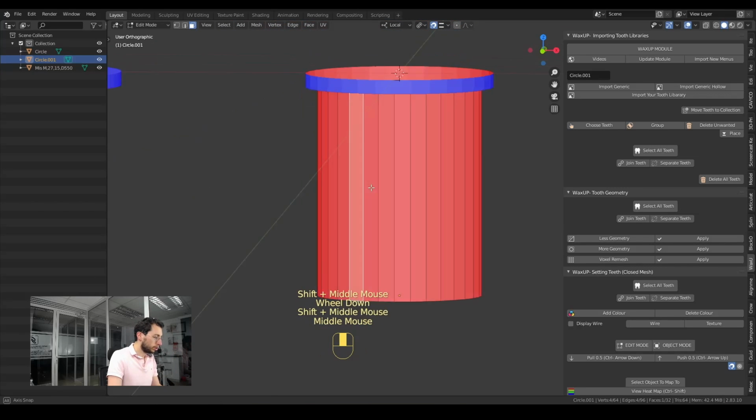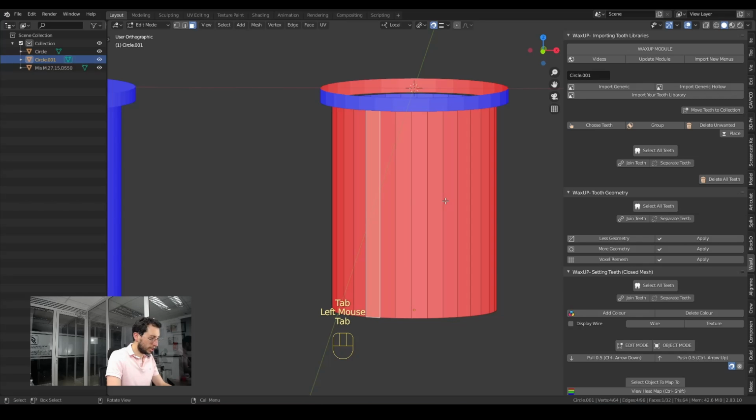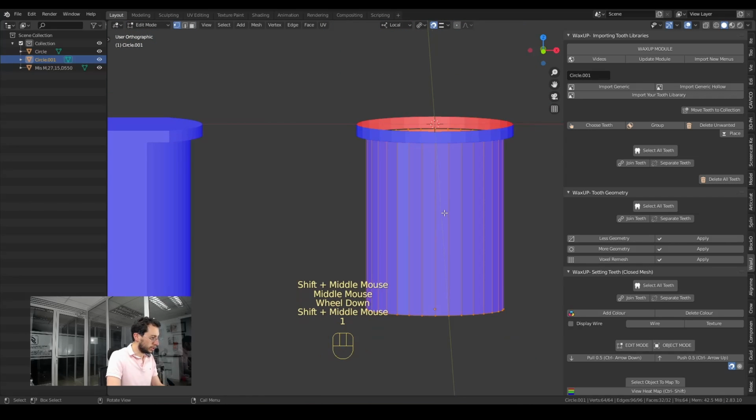inside out. So in order to flip it, I go into edit mode. I select this edit mode with Tab, then press A to select everything, Alt and N to show this menu, and click on flip. And now I have it in the correct orientation.